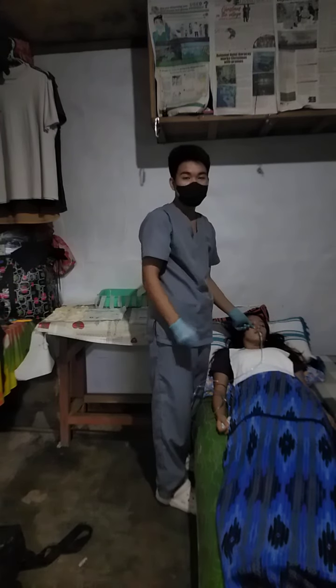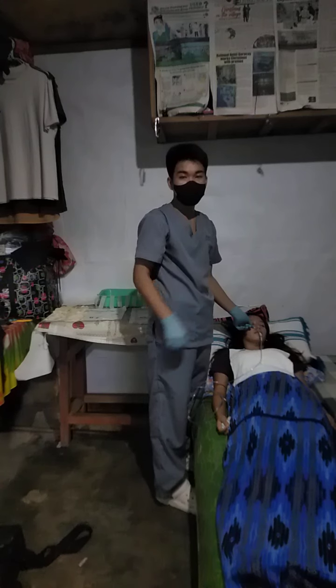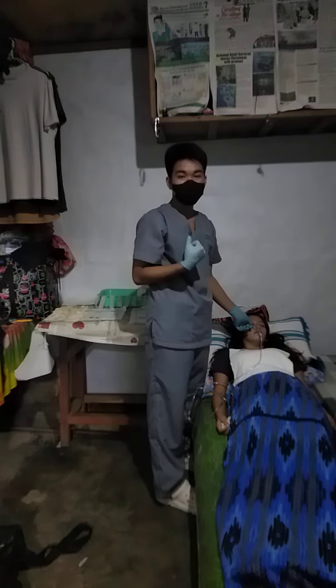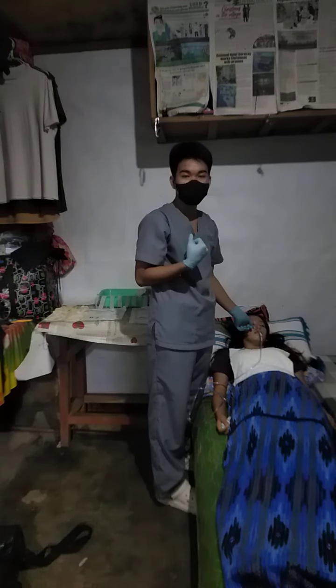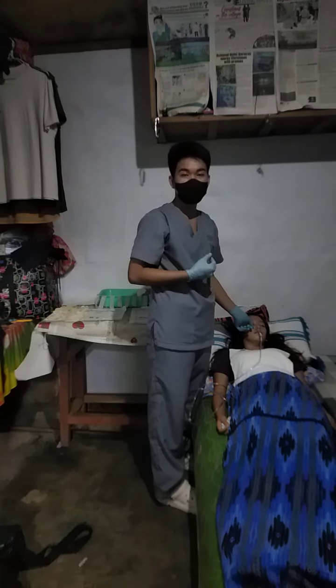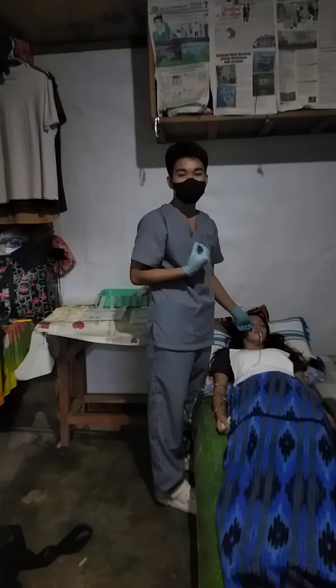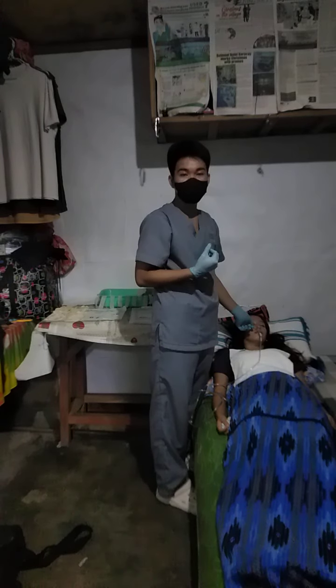Then discontinue the procedure and remove the tube if there are signs of distress such as gasping, coughing, cyanosis, and inability to speak or hum. The tube is in the airway if the patient shows signs of distress and cannot speak or hum. If after 3 attempts nasogastric insertion is unsuccessful, another nurse may try, or the patient should be referred to another healthcare professional.